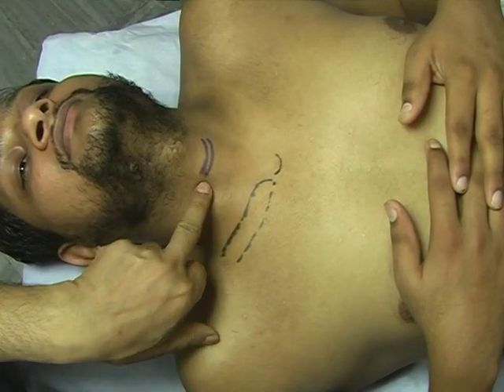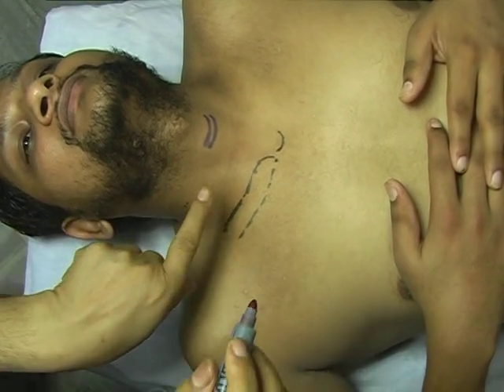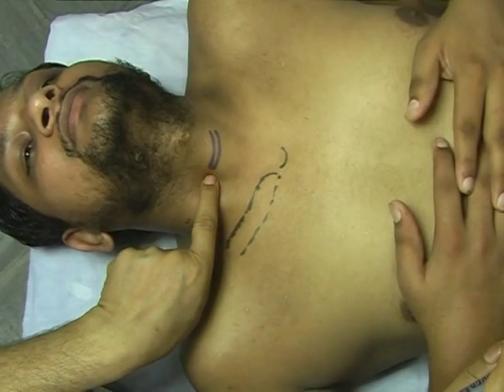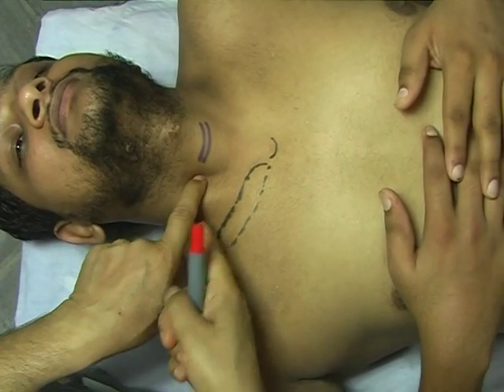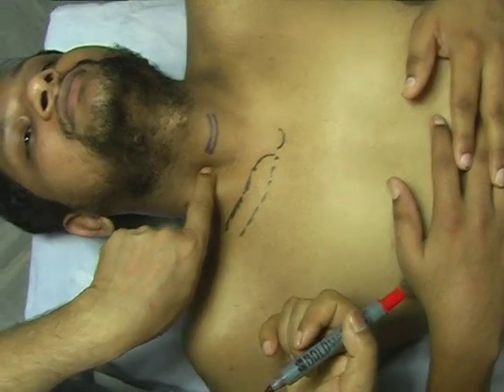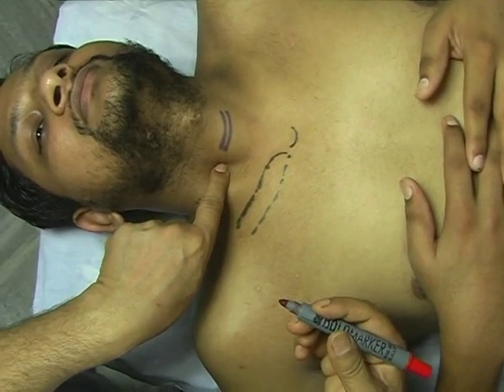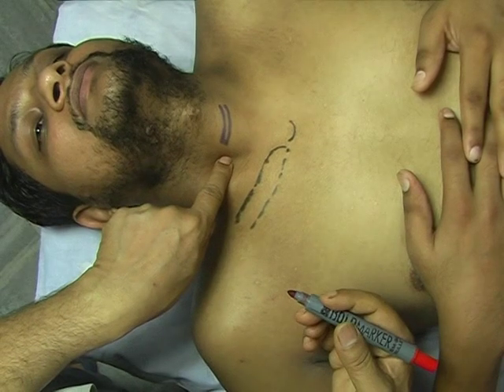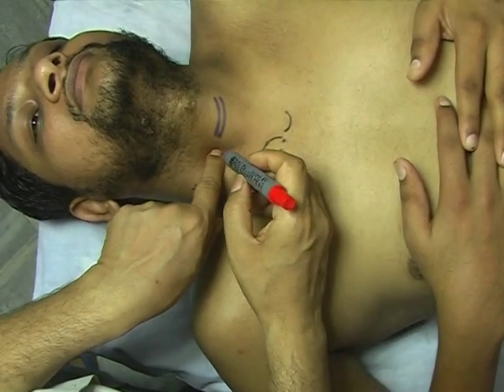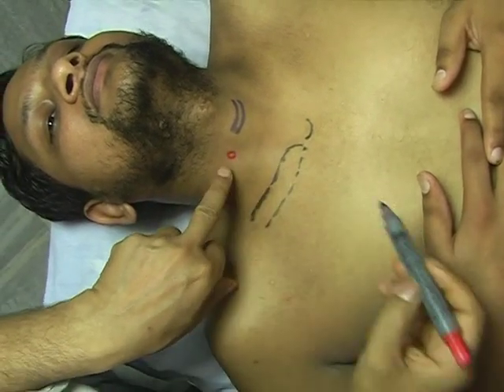Now at the level of the cricoid cartilage, you put your index finger in the lateral direction and just retract the sternocleidomastoid muscle laterally. At the tip of my index finger, I am feeling a hard structure — that is the Chassaignac's tubercle, or the transverse process of the cervical vertebra — and this should be the entry point of the needle. I am marking this point with a red circle.